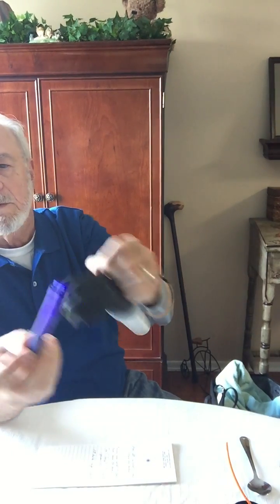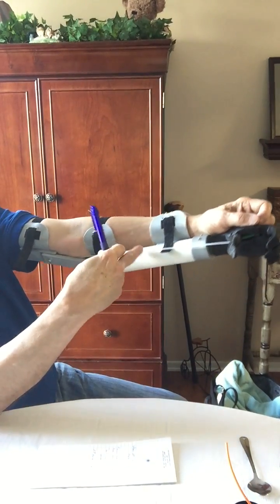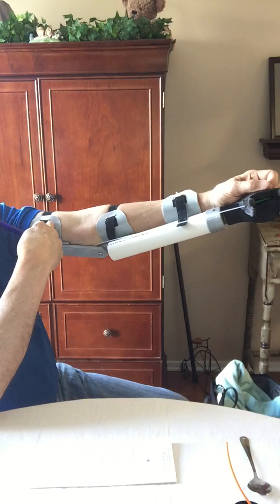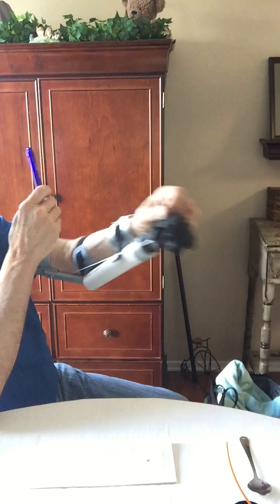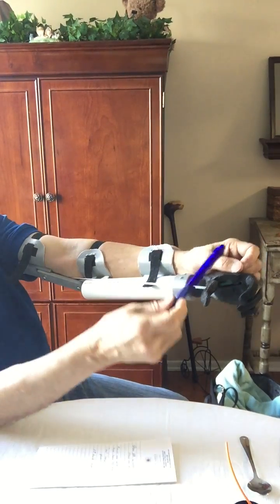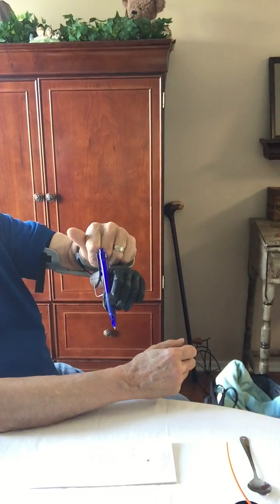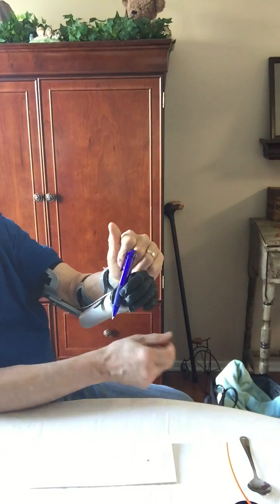And you can see how that works when you extend your arm, it pulls the Bowden cable, which is connected to the hinge between the triceps cuff and the cuff below the elbow, and runs to the thumb of this particular terminal device. So when I extend my arm, it pulls the thumb open. When I relax my arm or flex it, it allows the rubber band to pull the thumb closed. And as I said, it can rotate. And so that's a very useful feature.